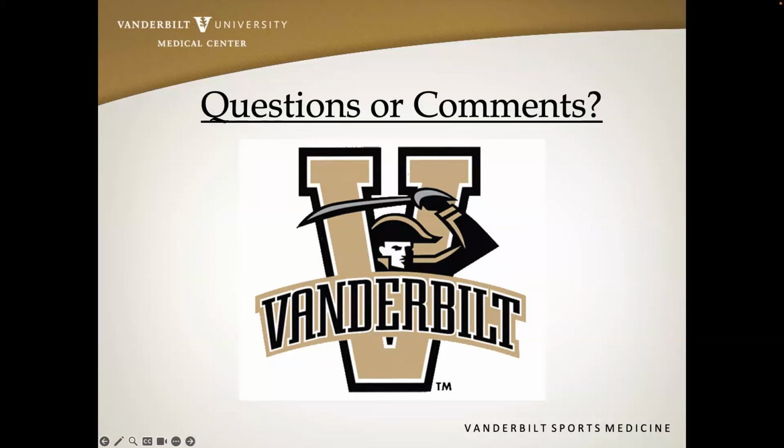And I also assess this recess fairly carefully on short axis, as well as look at both the medial and lateral patellofemoral gutters, because oftentimes you only see a slight amount of fluid within the suprapatellar recess, but you'll see a little more fluid in the patellofemoral gutters. So those are the areas that I look for fluid. And again, if I do see fluid, I have a low threshold for radiographs.